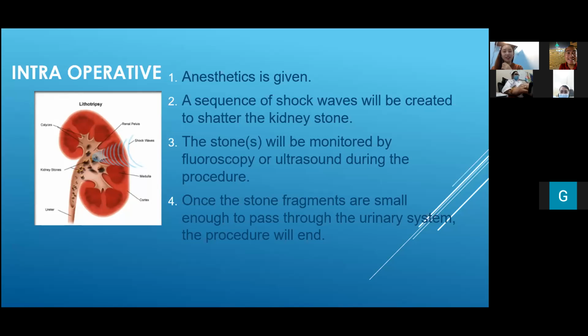Okay. Once the anesthetic is being given or inducted, it is our responsibility to take down the time the anesthetic was inducted and what kind of anesthetic our anesthesiologist gave. Then we will strap our patient during the administration of anesthetics because some of them feel like they are drunk or they will fall down on the bed if we do not strap them.